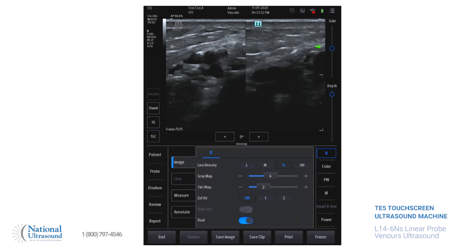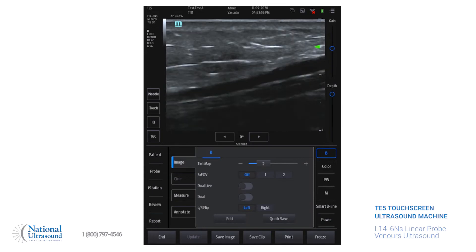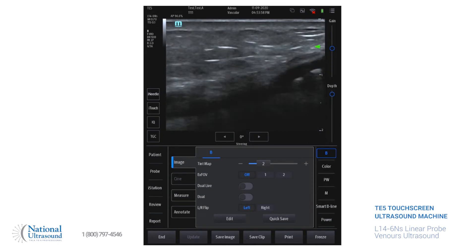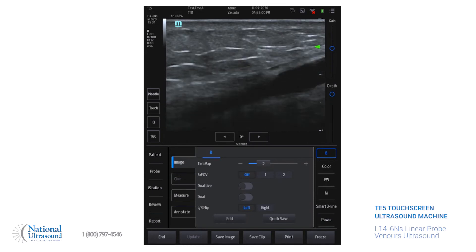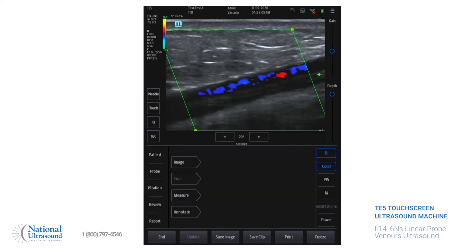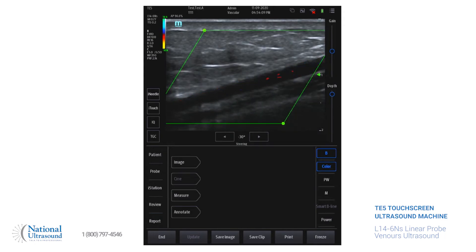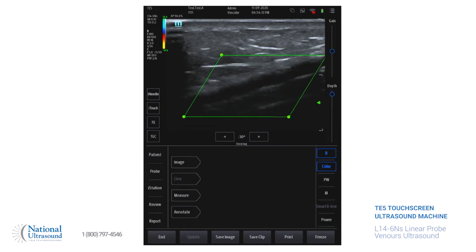Unfreeze. We're going to take the dual screen off. Then we're going to take a picture of it in 2D, take color, and then you can adjust how you want the box and move it up or down.